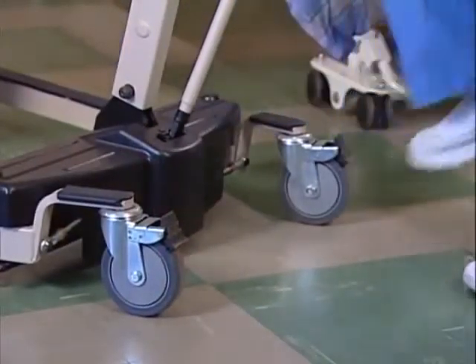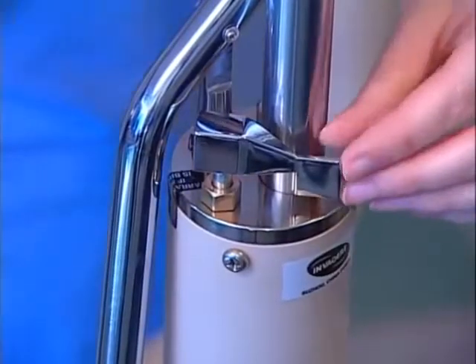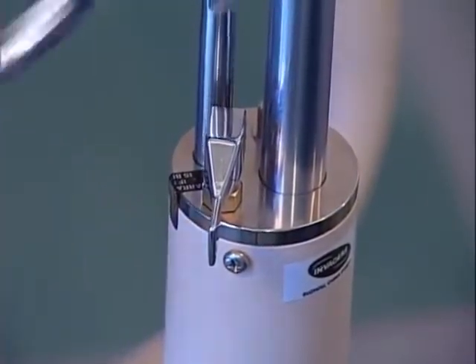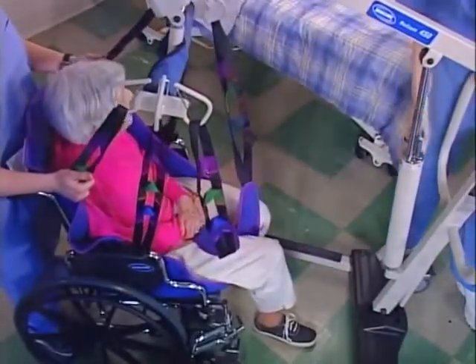Unlock the rear casters. Turn the control valve clockwise. Then give the unit a few pumps. This will elevate the swivel bar slightly and provide a bit of tension to the sling.